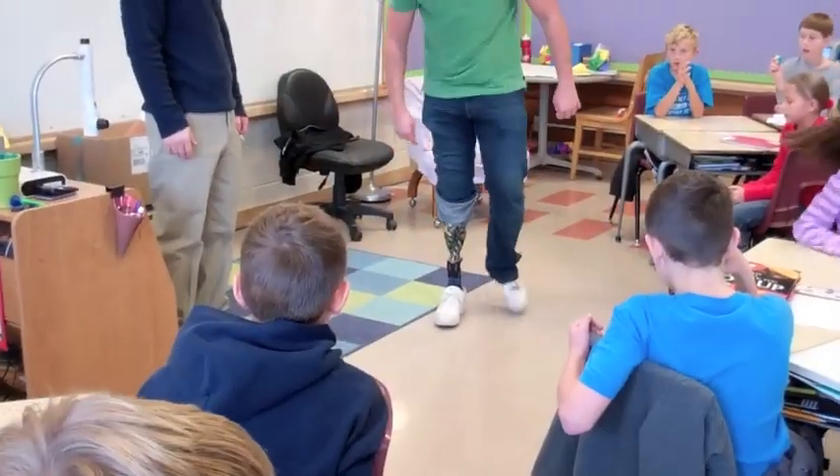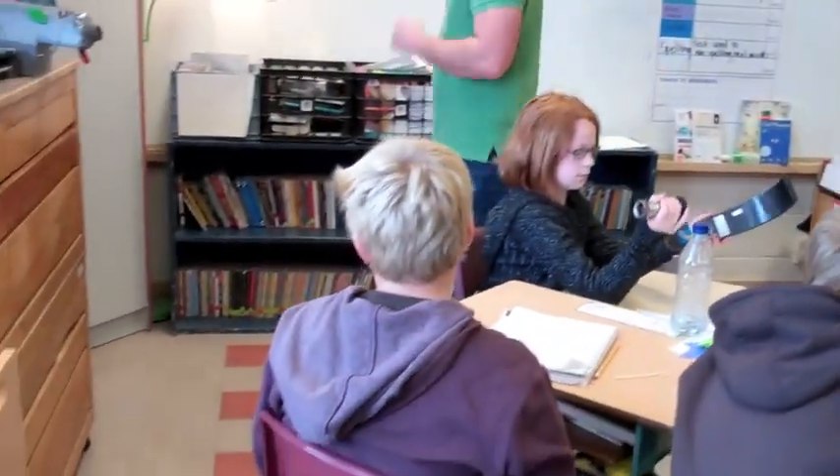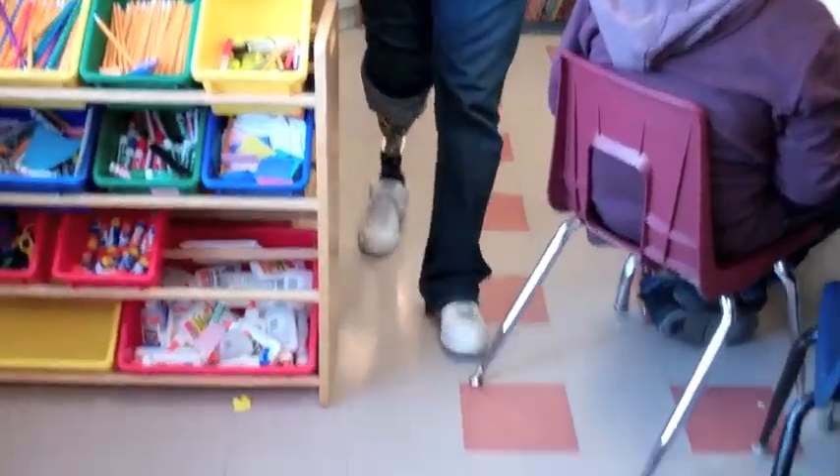I thought it was really rare for someone to have a fake leg. You taught me a lot. I remember when I was learning this — I was like, boy, I won't be able to do that, with the valve in there and all that. But you really don't need it.